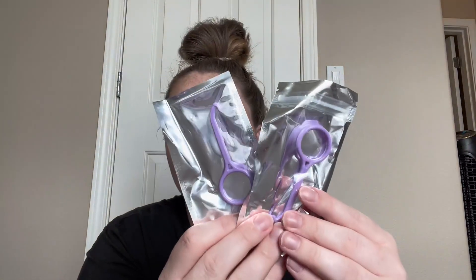It also comes with some cool things as well. It comes with this toothbrush cleaner, which will be super, super nice for my retainers, and some of these little things as well.